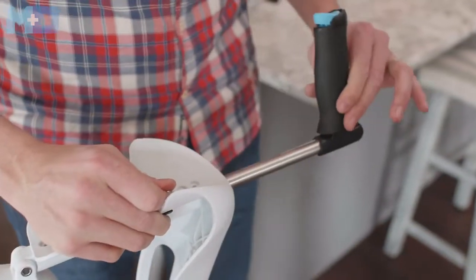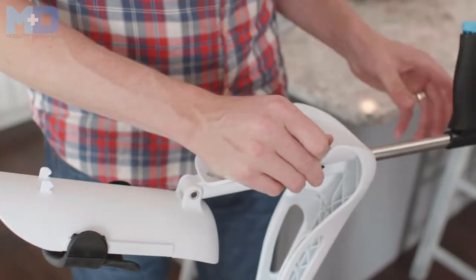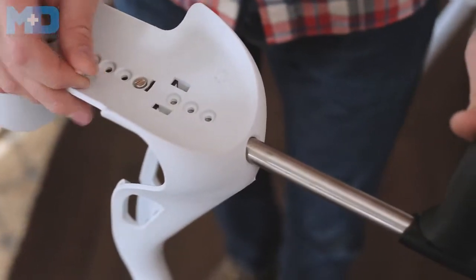What you don't want is a lot of rotation in your handle. The handle has a little bit of jiggle to it, but very slight. Now that your screw is in place, you can close your cradle.